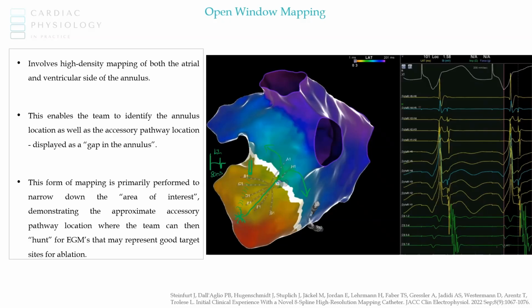And if we move our catheter just a few millimeters away, so let's say we put our catheter here. Let me do this in a different color so that we can actually see it. Let me do this in red. So if we move our catheter here, just on the atrial side of the annulus, just a few millimeters away, and then we measure the timing. How long does it take to go from our pacing spike to the EGM that we see here? Now we're going to see an atrial EGM here because we're on the atrial side of the annulus.